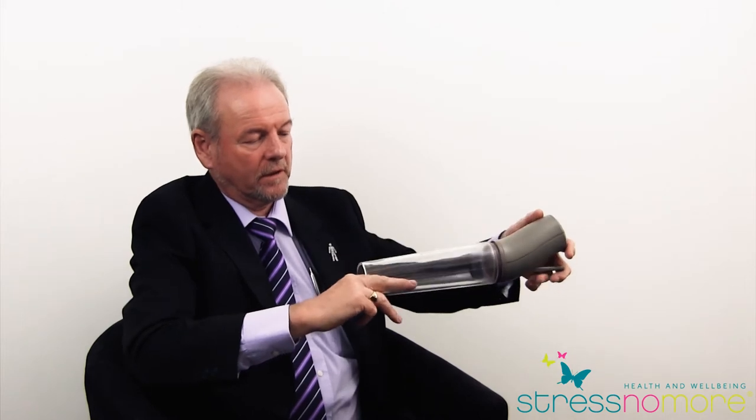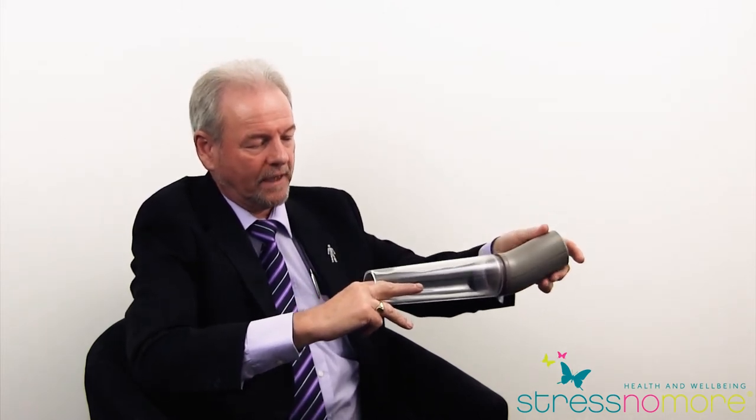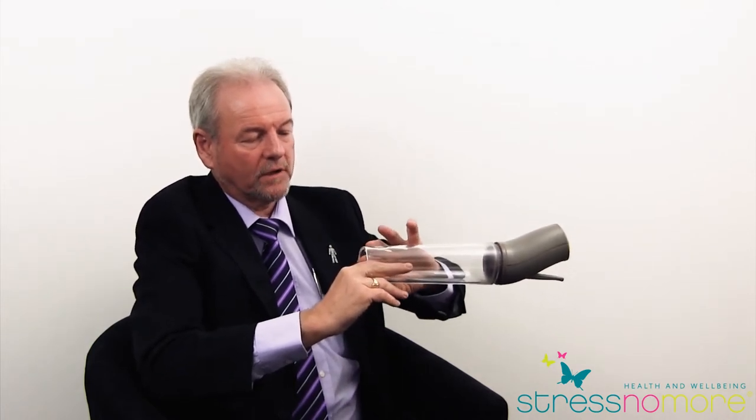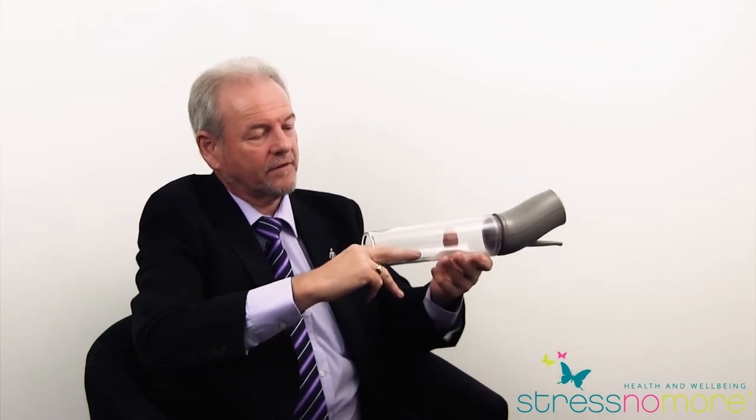Having positioned the penis inside the cylinder, you pump gently and as you create the negative pressure in the cylinder, the blood is encouraged to flow into the shaft of the penis and into the head of the penis.